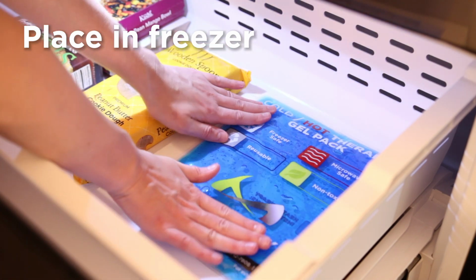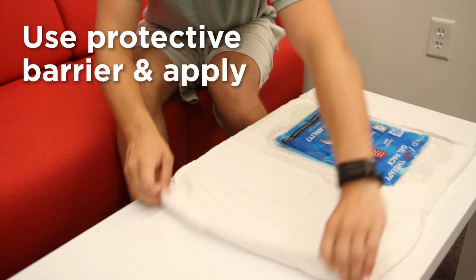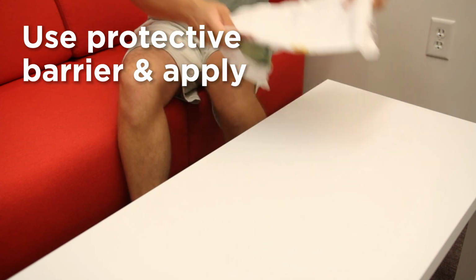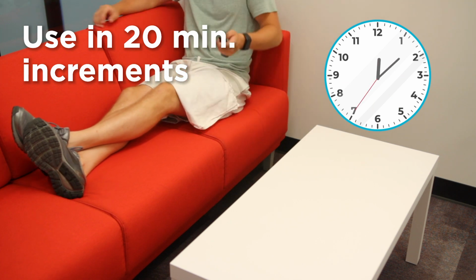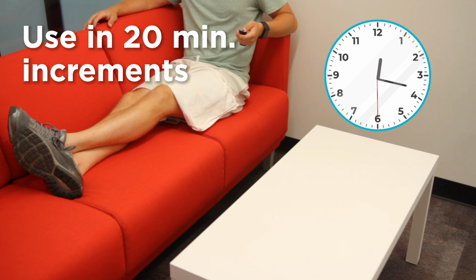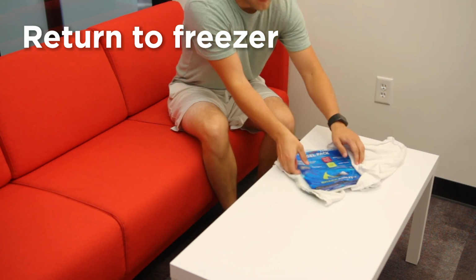Place flattened gel pack in freezer for at least 4 hours. Wrap it in a cloth towel or other protective covering, then apply to affected area. Use in 20-minute increments or as medically prescribed, allowing your skin to warm before reapplying. Return gel pack to freezer between uses.